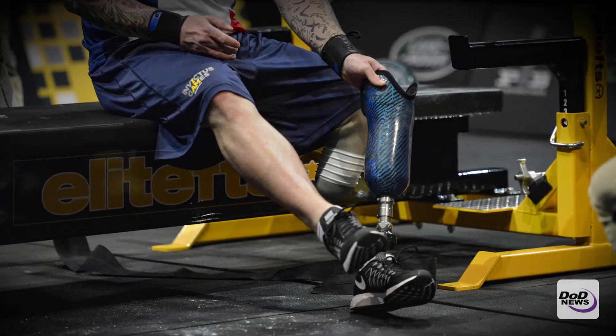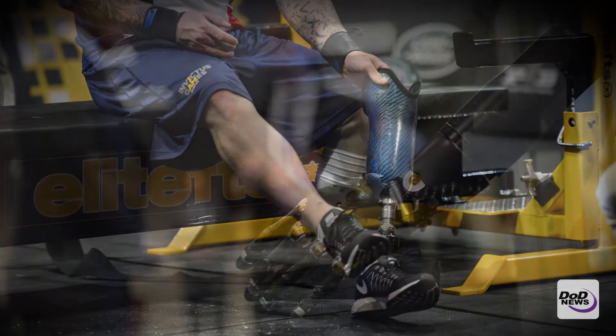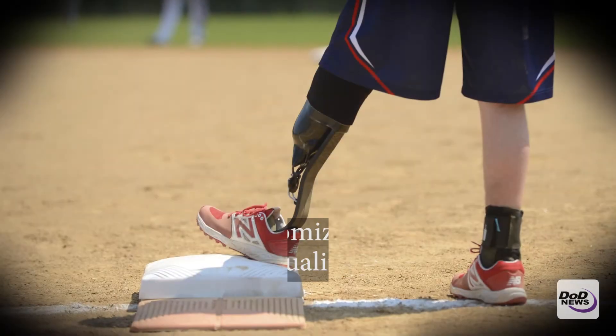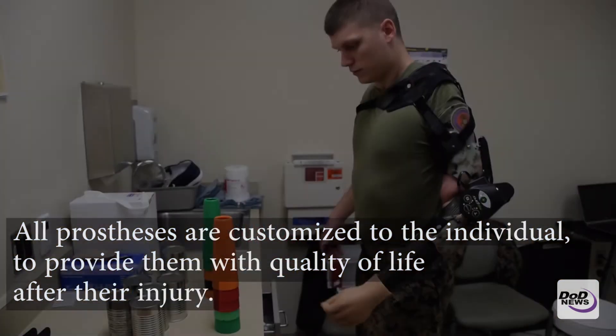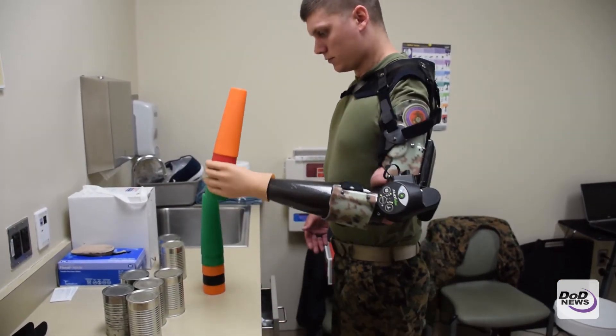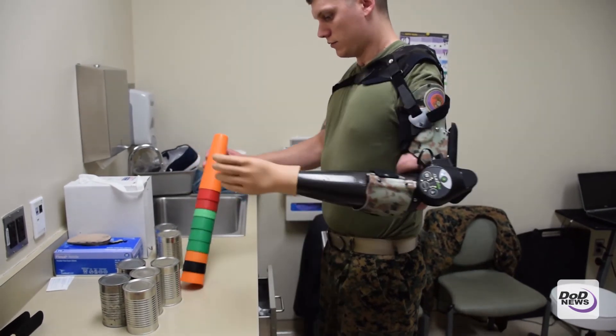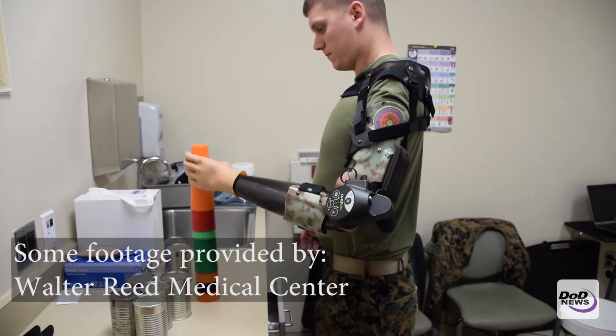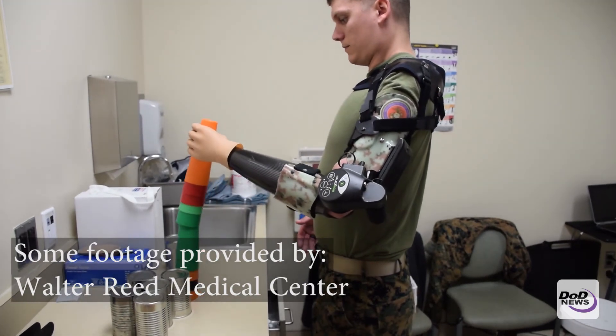We use different components — different hands, different wrists, different elbow systems — to customize each prosthesis. Each socket is a customized device or component, customized to each individual to make sure they are fit proper.